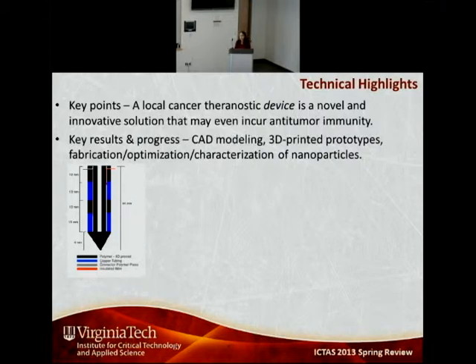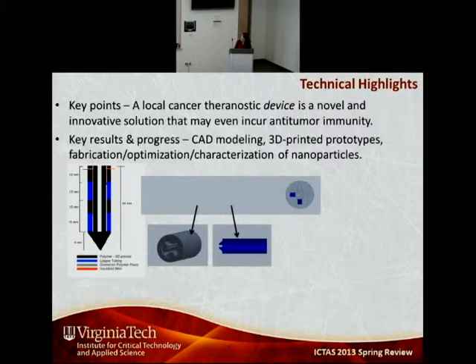Another thing is the plated system. The plated components have these protrusions sticking out on the end, and that's really to facilitate the soldering of the electrodes, so you don't have to worry about trying to internalize that. So we actually have a big prototype. This is a 10x compared to what it would be for 19 gauge, and that's just to help us figure out what we need to optimize and make better.